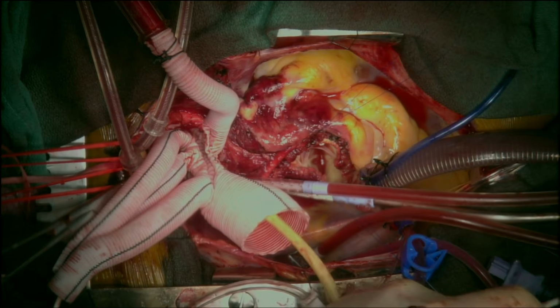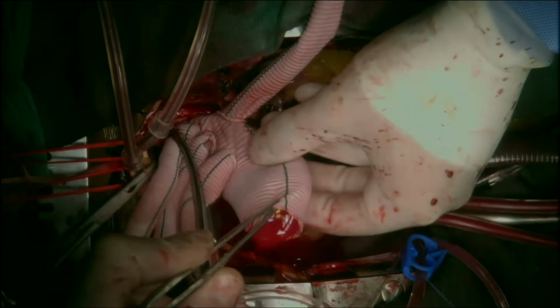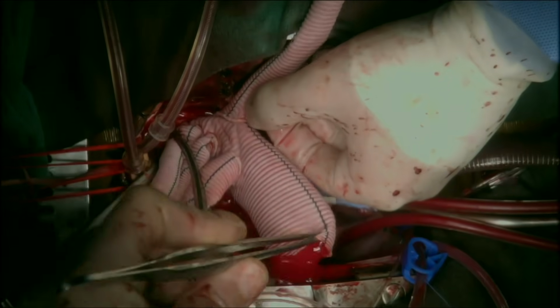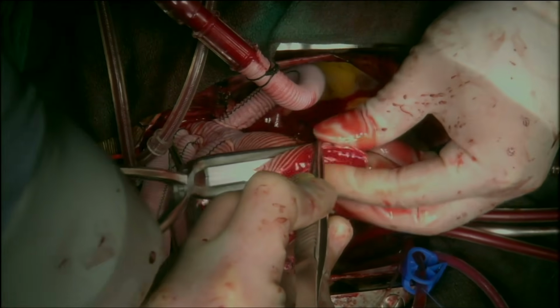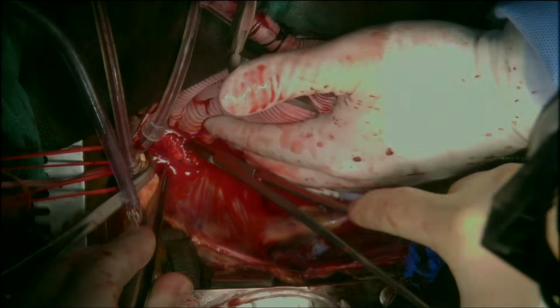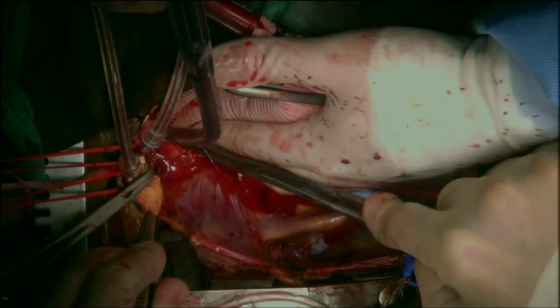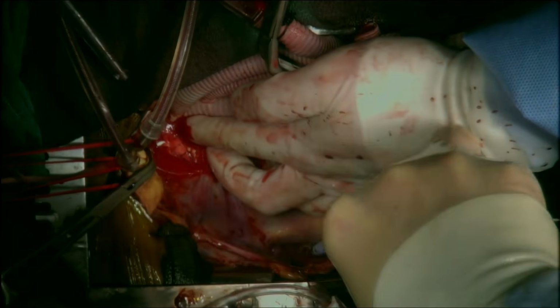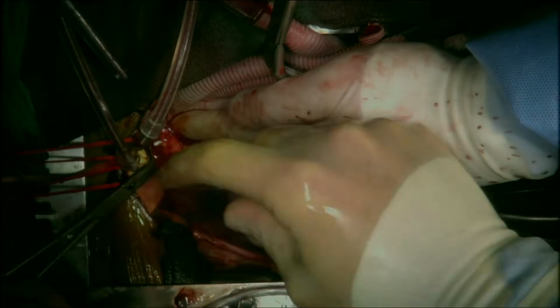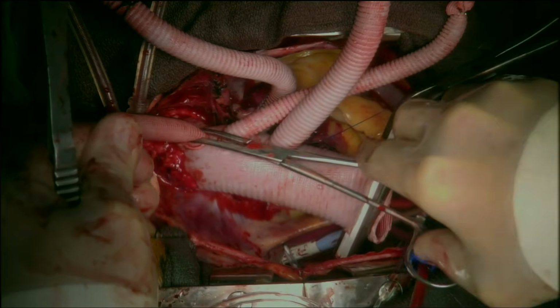Branches for the head vessels were clamped. The proximal end of the graft was cross-clamped after careful de-airing, and flows were slowly brought up to full flows. The distal anastomosis was reinforced with multiple pledgeted Prolene sutures, as achieving hemostasis at this point is crucial. Of note, the right femoral arterial pressure became equal with the left, and thus the perfusion through the 6 French sheath in the right groin was disconnected from the ACP line.